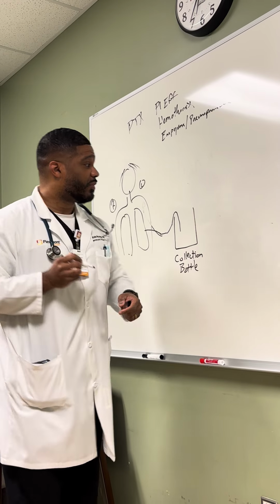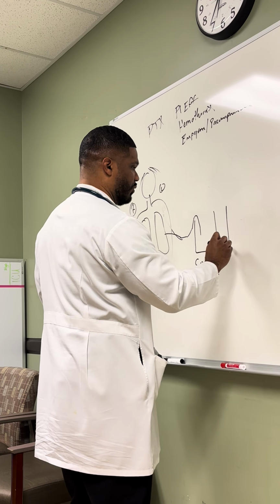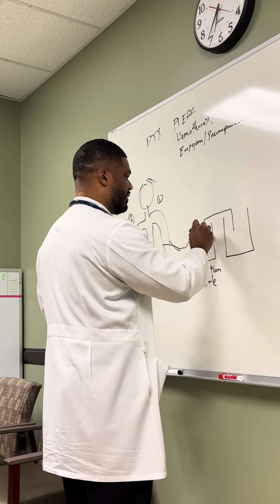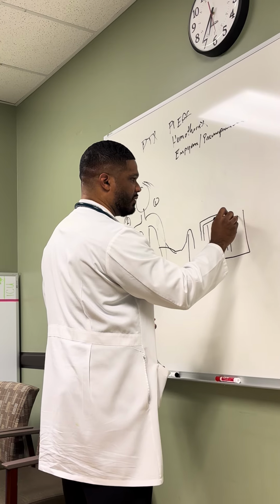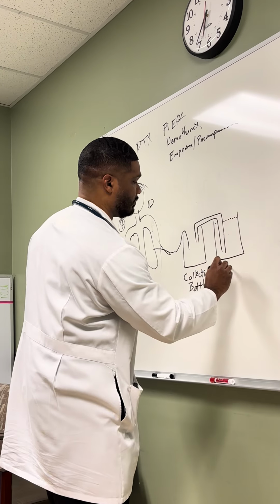And so we wised up over time and we started to close the collection bottle off to the environment, and we made another bottle called a water seal, okay?